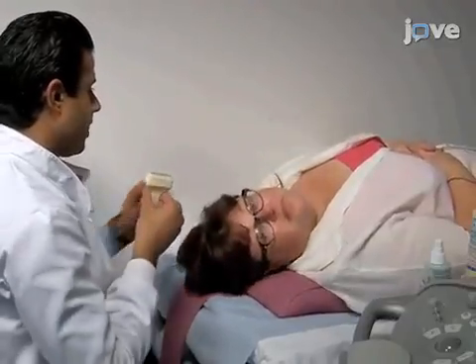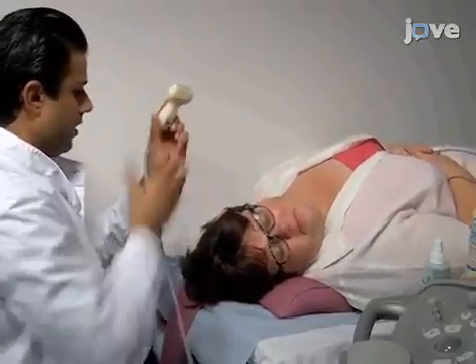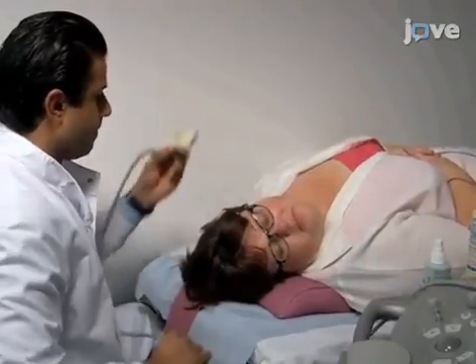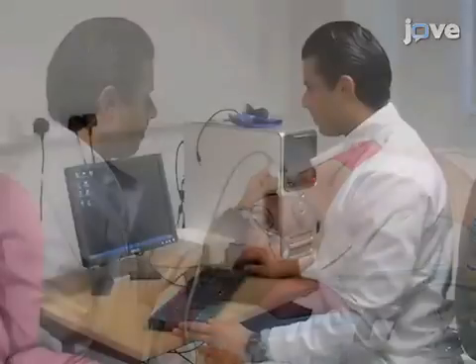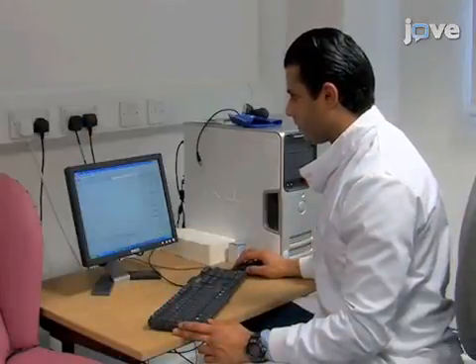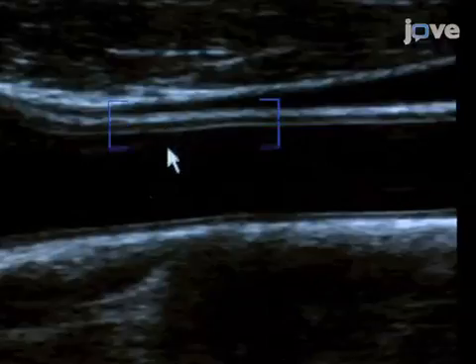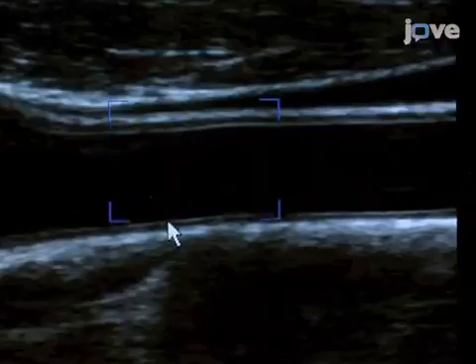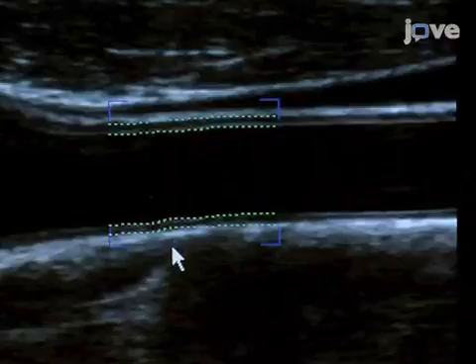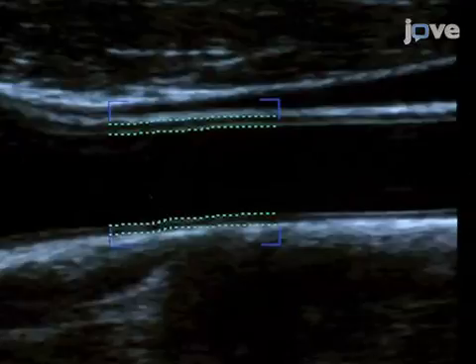Have the participant roll their head to the other side and repeat the procedure to document the left carotid artery. Later, analyze the images offline using the Artery Measurement Software package. While collecting the values for CIMT and lumen diameter, be aware that accurate readings from the near wall can't be made, so only analyze readings from the far wall.